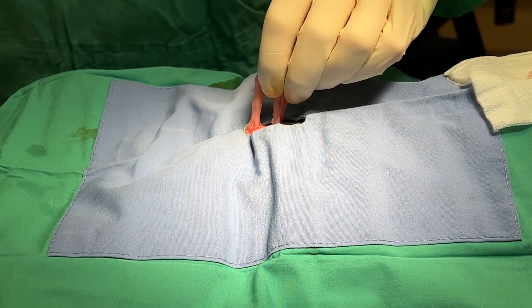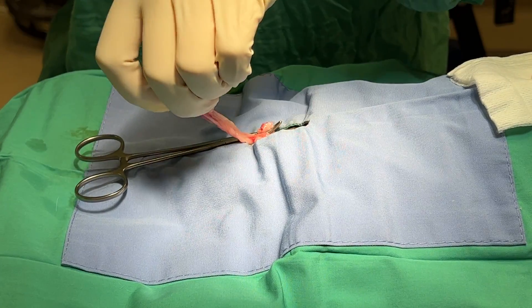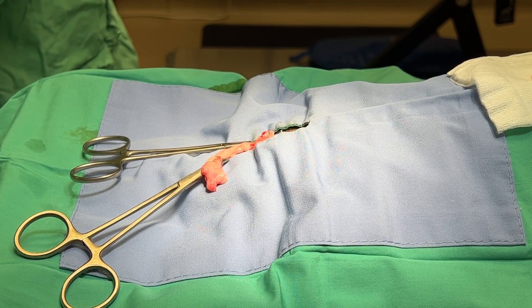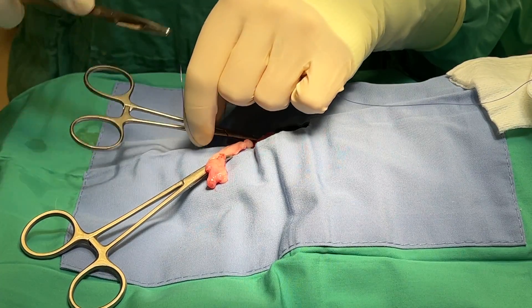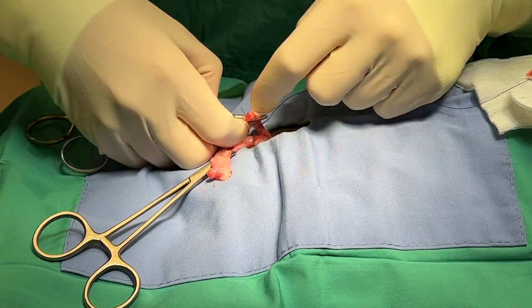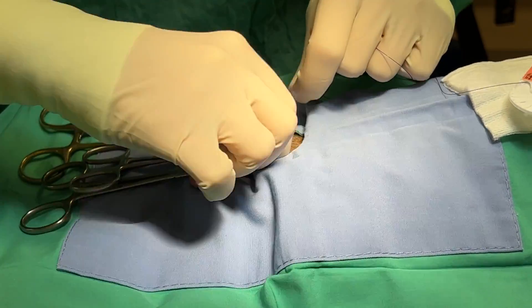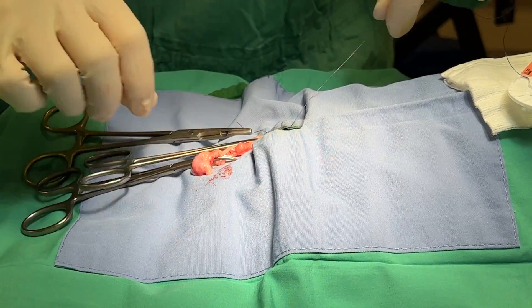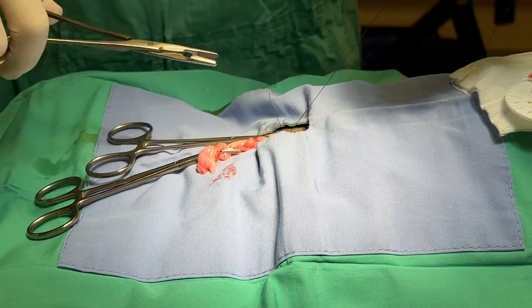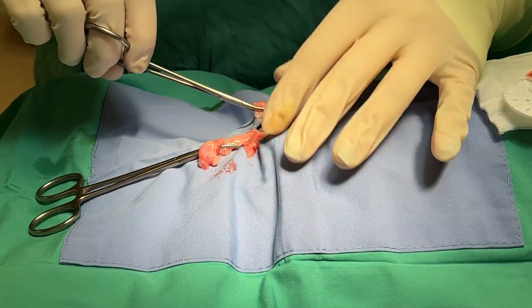Moving on — place a clamp on the pedicle, and I cut my ovary, then do a miller's knot over my clamp, lift up my clamp, and seat my ligature on that pedicle. Get this out of the way. A few more throws, and I can let that go.